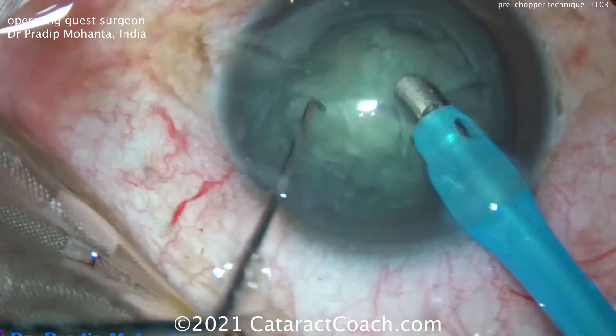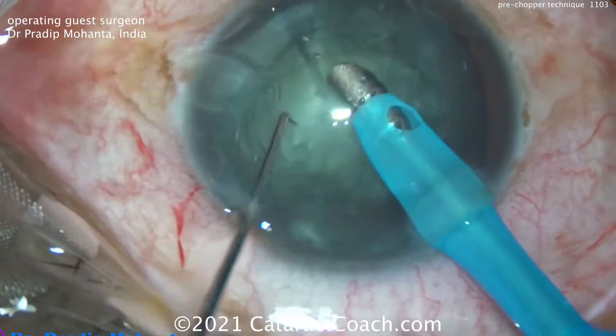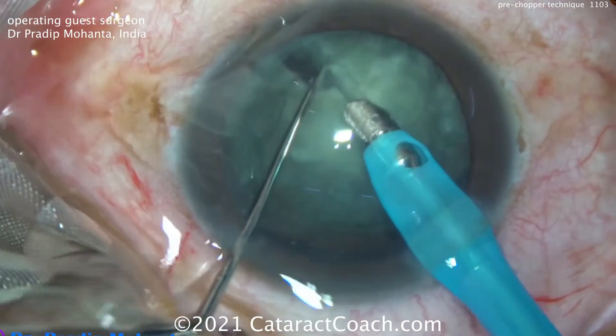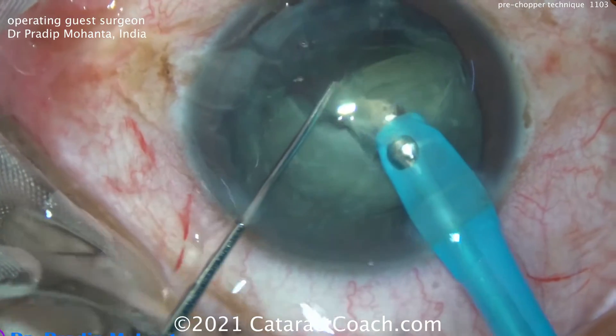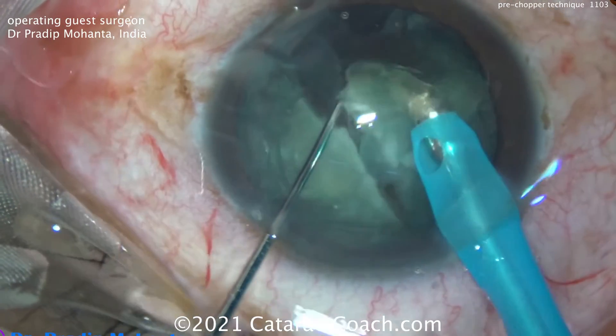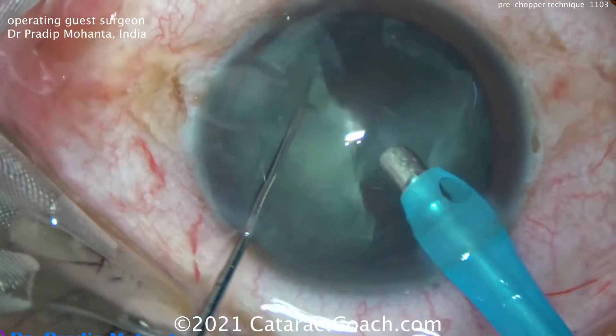It holds the nucleus still. Now these pieces can be removed very easily. It looks like there are two quadrants and then one half still in the bag. You can separate the halves into even smaller fragments. There you go — you can see that fault line. We can separate it, bring it up. Now it can be chopped with that Sinski hook or other instrument if needed, or simply emulsified.